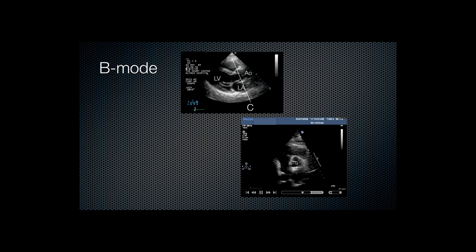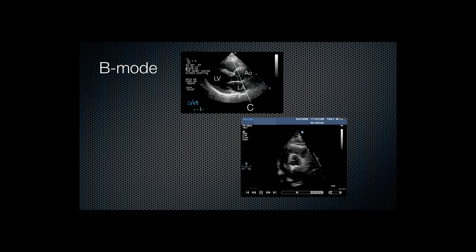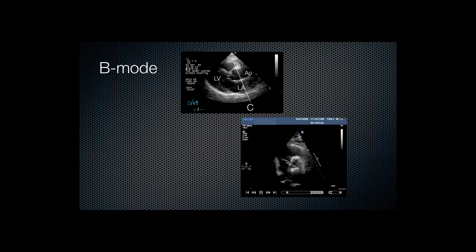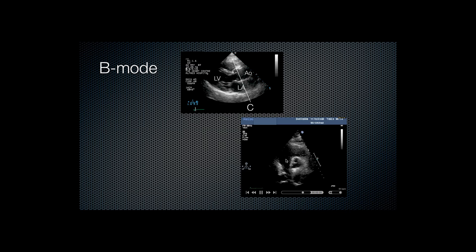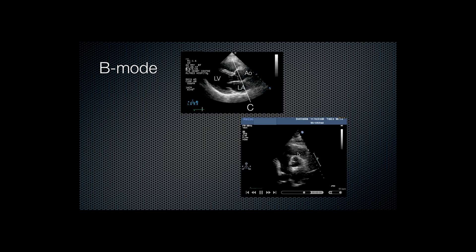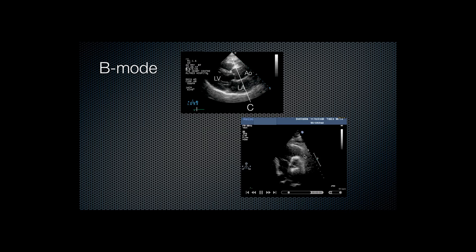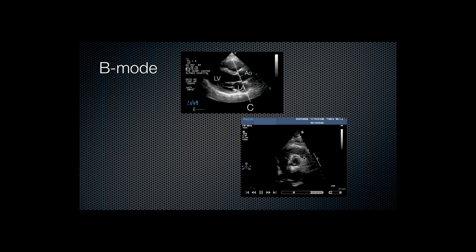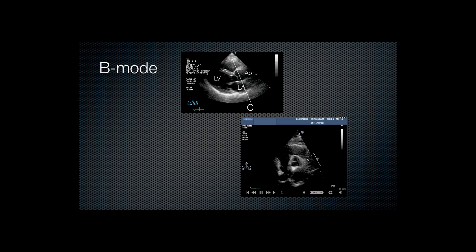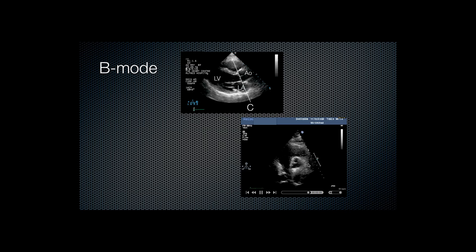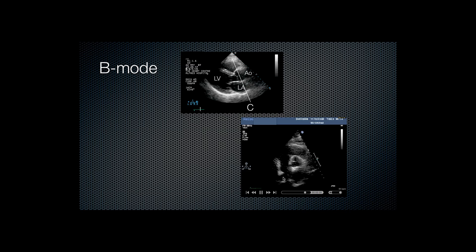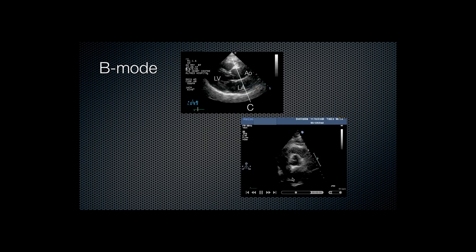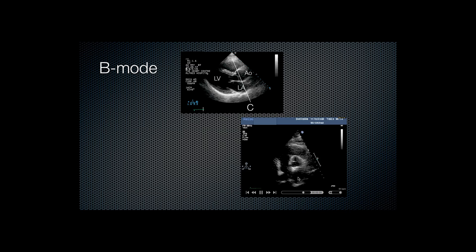The other structures, here we have the right atrium. This flapping structure here is the tricuspid valve. This is the right ventricle outflow tract. Just faintly visible is a linear structure here that appears to open and close. That's the pulmonary valve. Main pulmonary artery descending on the right of screen here. I mentioned this is the right atrium. Inferior vena cava. Interatrial septum. And this is the left atrium.